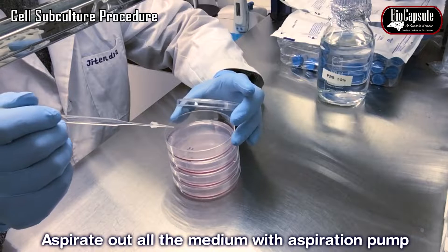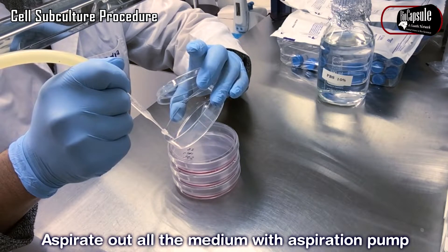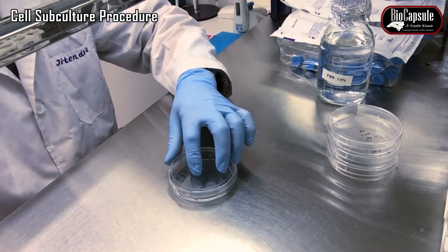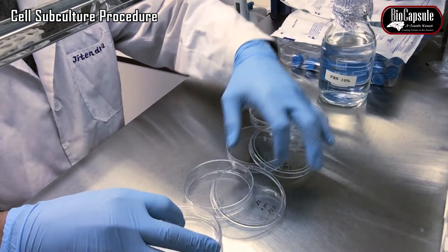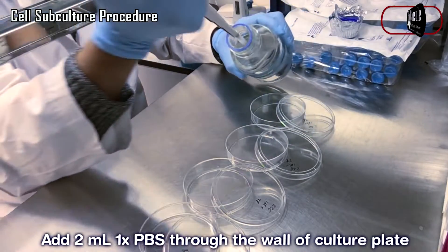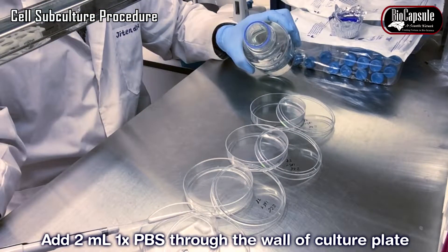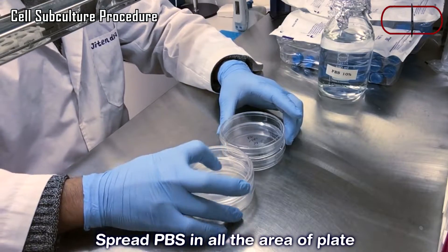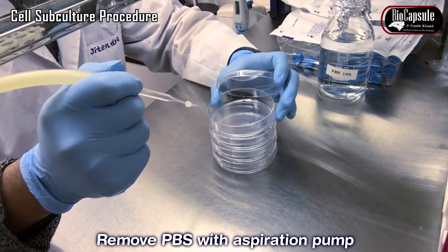Remove the culture medium with an aspiration pump. Add 2 to 3 ml of PBS through the wall of the culture plate — never add PBS directly to the cells, because it can detach the cells from the surface. Spread the PBS over all areas of the cell culture plate, then remove the PBS with aspiration.